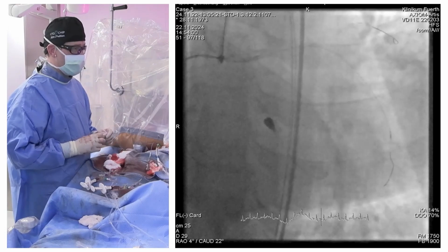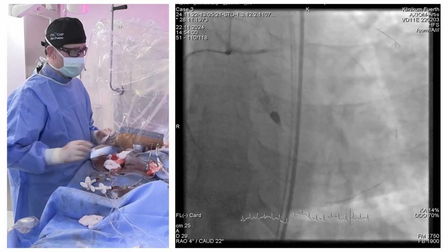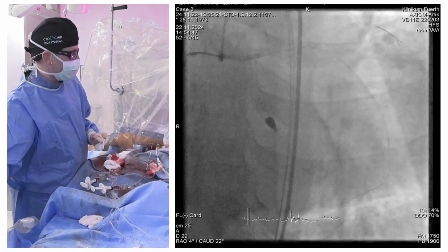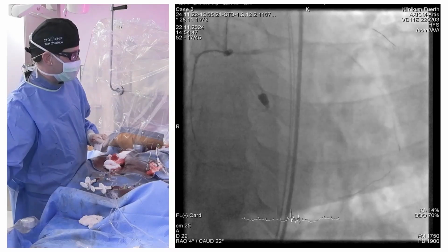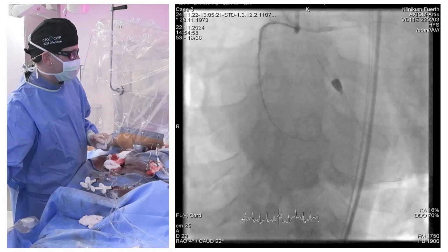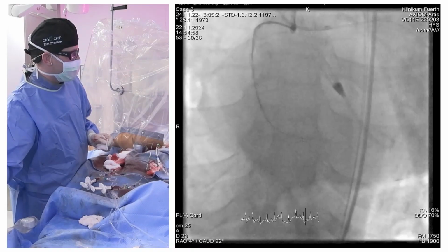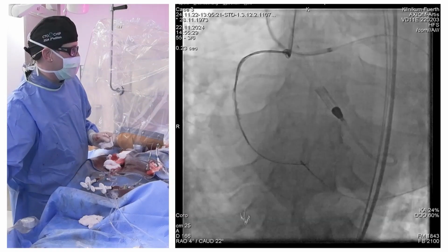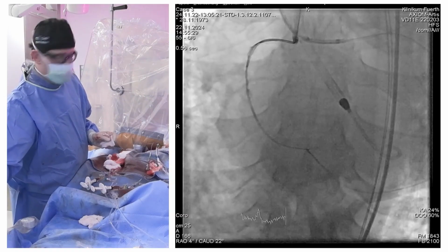And this is the septal, or this is a crossing basically with a Suoh. And then it went relatively far already, basically down to the bifurcation. It was a little surprising for us. And then we are basically stuck there in this 90-degree angle bifurcation part.